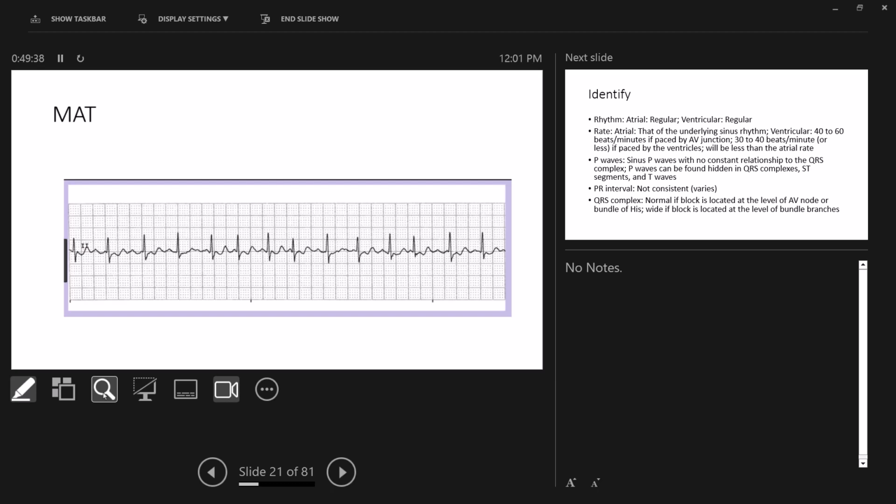So now remember, MAT is a precursor to atrial fibrillation. All right, and so in atrial fibrillation, somebody tell me what is the pathophysiology? What's happening in an AFib? The atria is, okay, which shows up on our EKGs as having multiple little fibrillation, little F waves. If you're looking at this one right here, I would agree with you, okay?